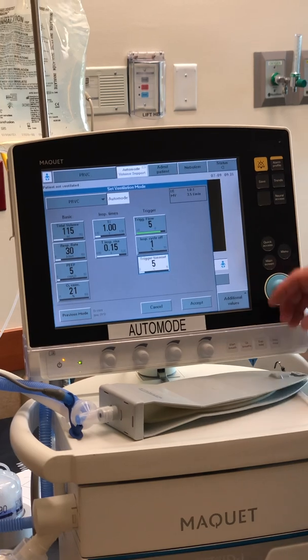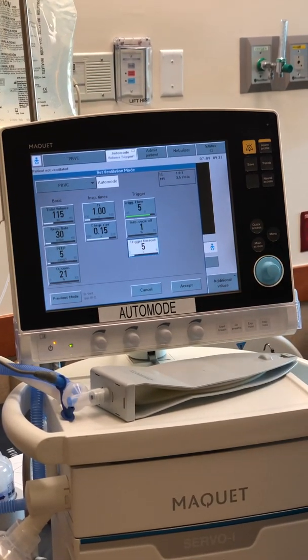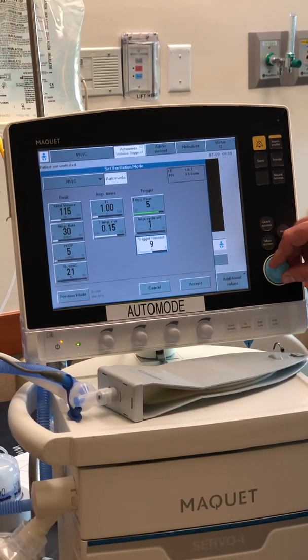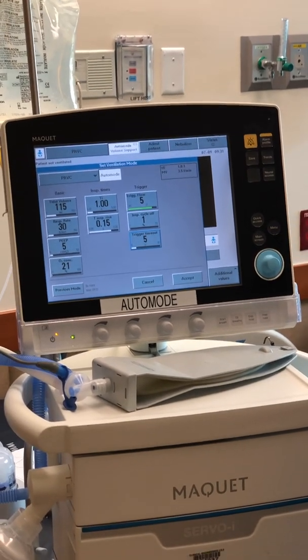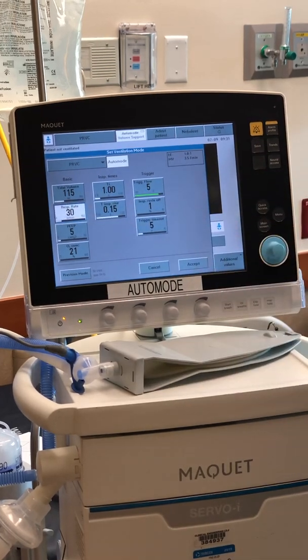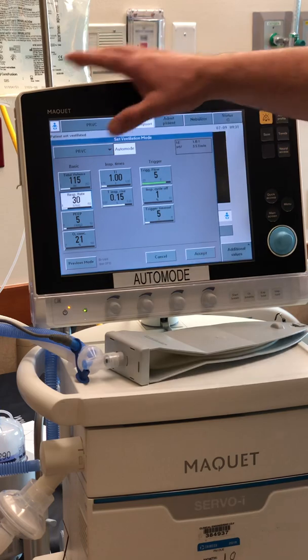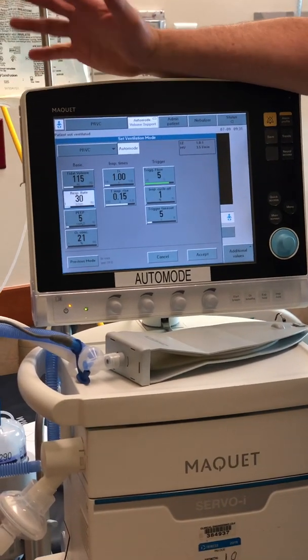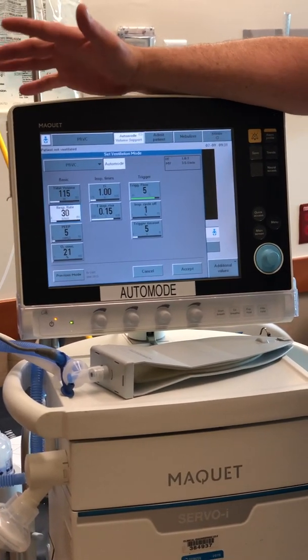An infant in CCU typically takes a breath about every five seconds. The older the patient, the longer you'll want that trigger timeout to be. Let's set it at five seconds for now as an example for infant rates. For the backup rate in auto mode, you need a good feel for what the patient's minute volume needs to be for adequate gas exchange.